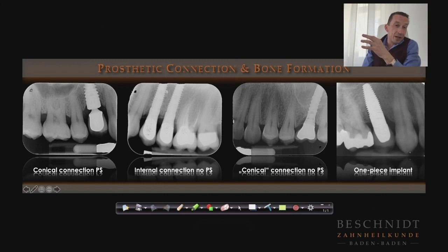You see a very large implant and a very tiny implant abutment connection with a large platform switching, but although we have this, we might have a bony resorption. So let's discuss if platform switching alone is the miracle. Because then look at the other picture here. We don't have any platform switching and we have no bony resorption.